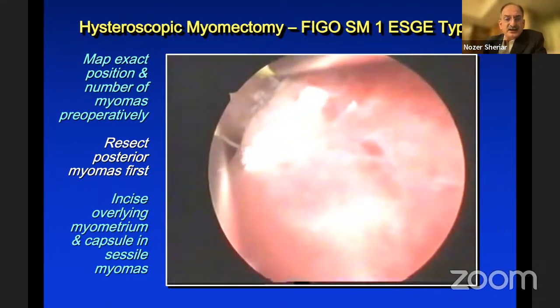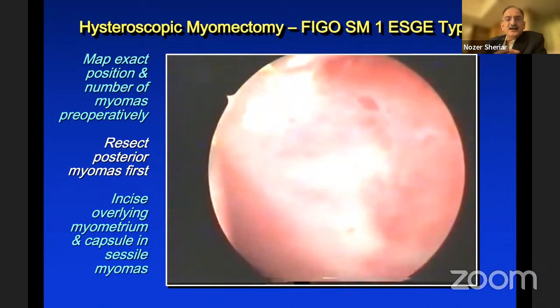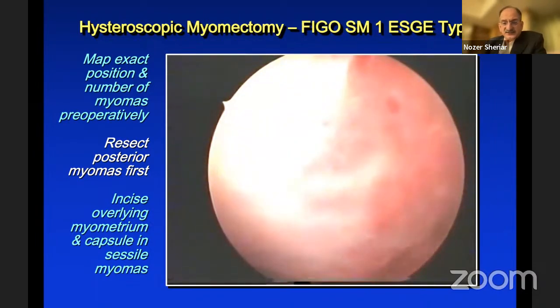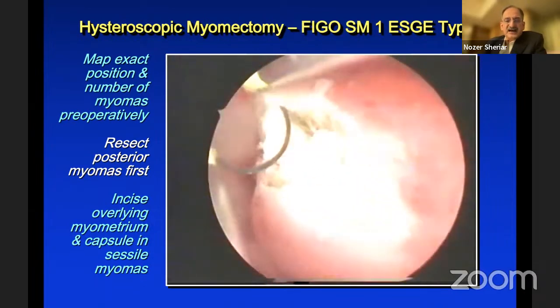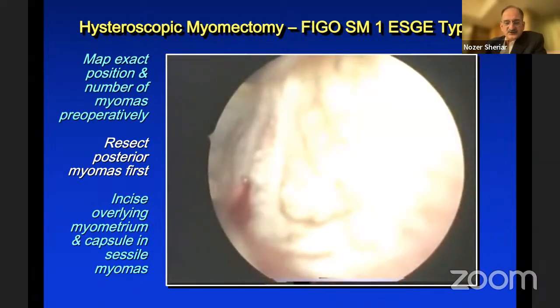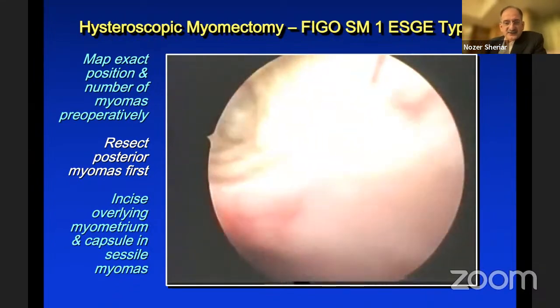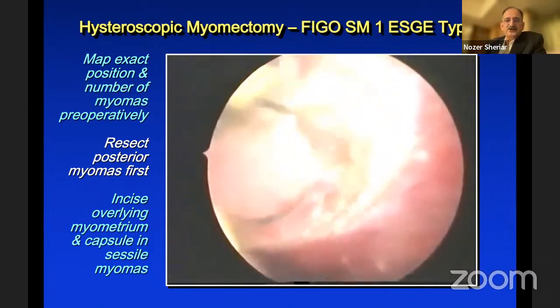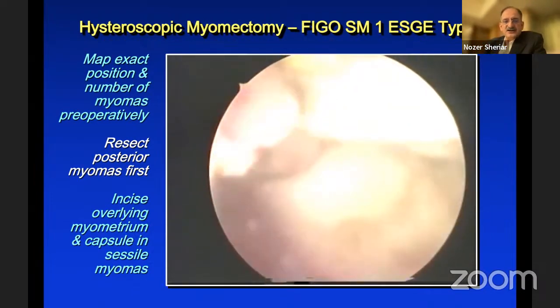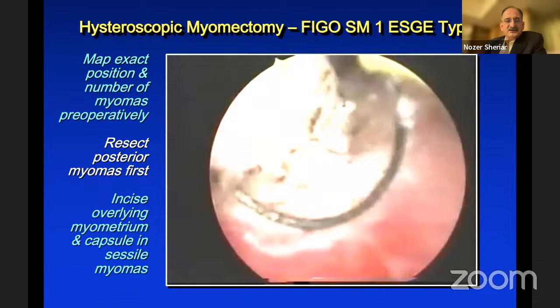And the first thing you do, and I heard a panelist saying that there is nothing like 3D ultrasound. Okay. I do not need to put in a scope to make this diagnosis. Interestingly, in this patient, I also have an HSG and I do those a lot. Watch those blood vessels. Don't be afraid of them. It tells me my pressure gradient is towards the uterine cavity.